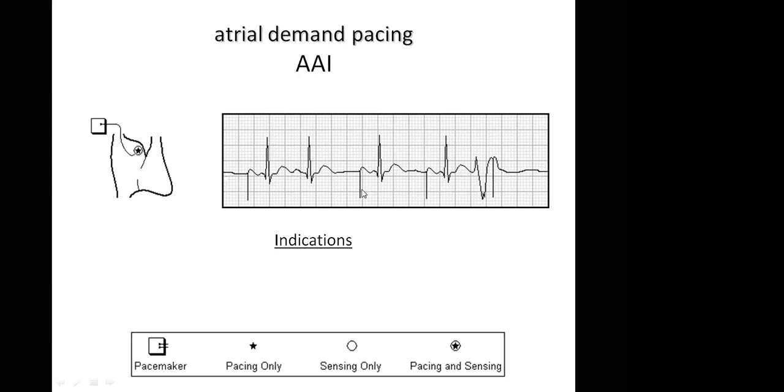I said those ones you are touching, they are the paced wave. Paced wave, yeah. Right? That's the aim of the pacemaker. But what of that other small deflection? No, so it's just an electrical deflection. It's not a particular wave. Electrical deflection is not a particular wave.